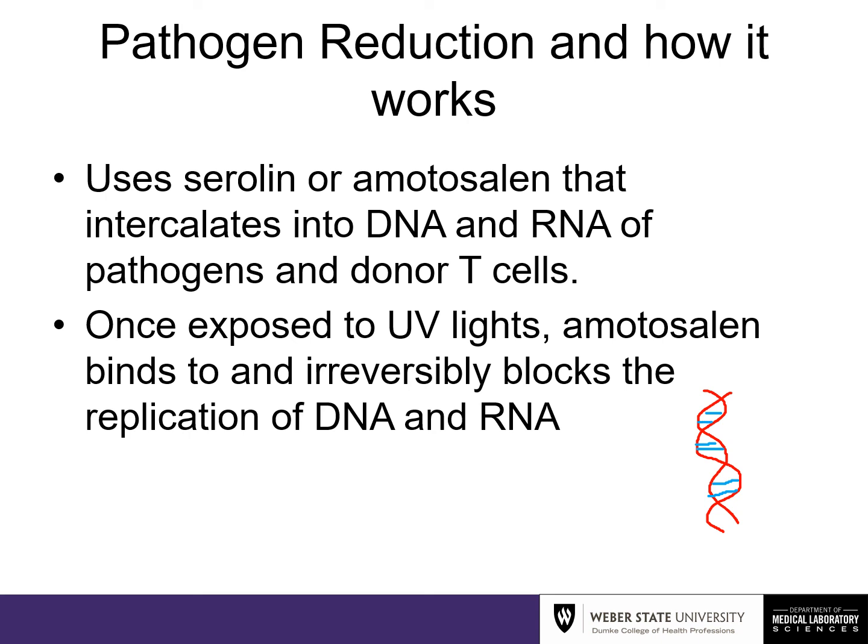And then we're going to have UV light come. As you can see, the things in blue are the amotosalen, and the red is the DNA strand.